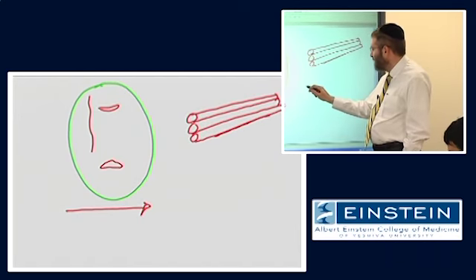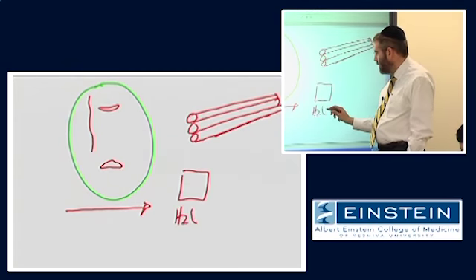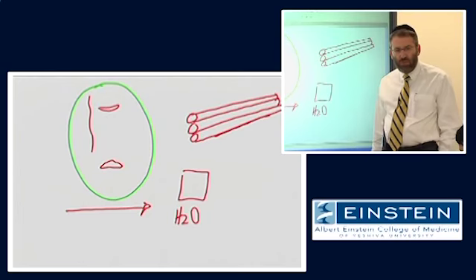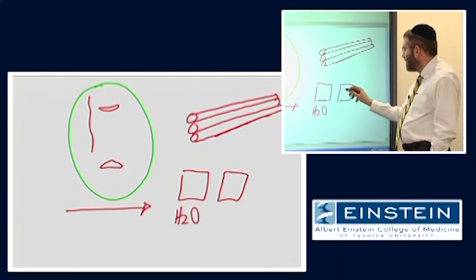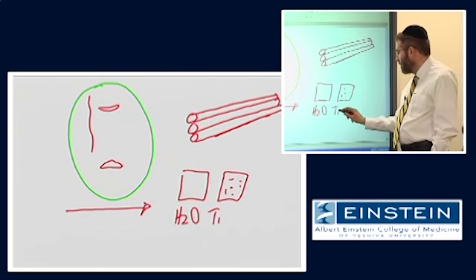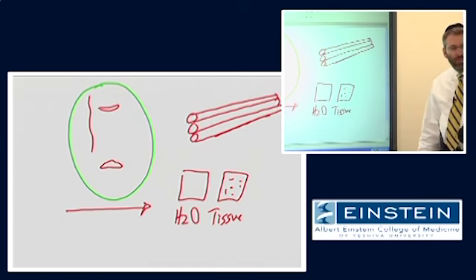So when we talked about the simple example of our bucket of water, or my glass of water sitting here on the table, where diffusion could move in any direction, in tissue, we said that there was all kinds of other stuff, macromolecules, cell membranes, organelles, that slowed down the rate of diffusion.